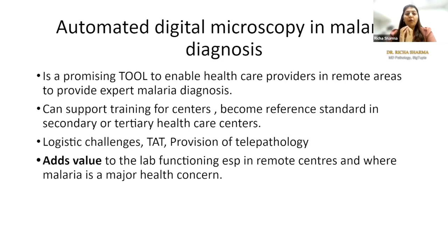And overall, it's just a tool. It is not making decisions for you. If you do not agree with the predictions, you can always say no and give it as a negative report. So rest assured that AI is not making decisions for you. It is only and only adding value.